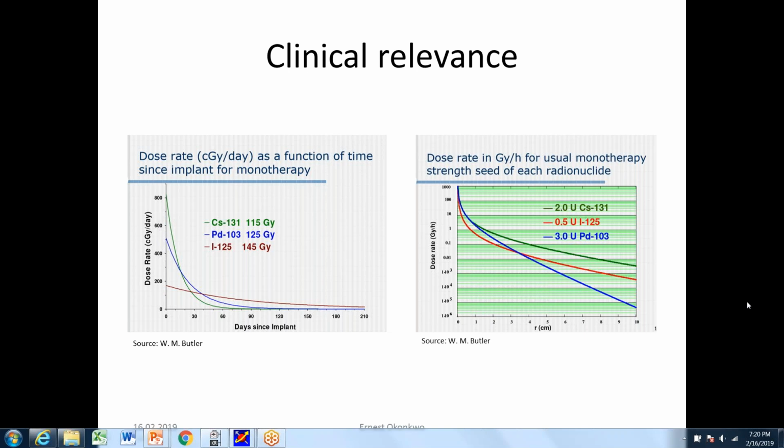So we go back to find out where the mistake was. There was a case with the loader. Somehow the needle in the loader was a little bit bent, so we couldn't configure the seed rightly, so the seed went missing inside the loader. So we had to dismantle the loader immediately, and we could recover that seed. So it goes back to communication. You always have to communicate with your team.